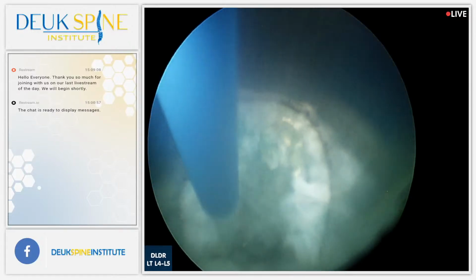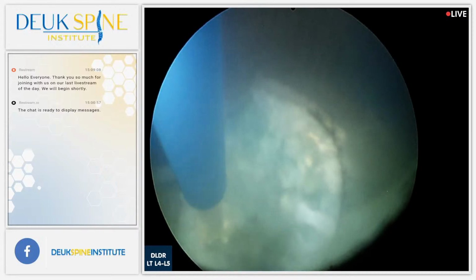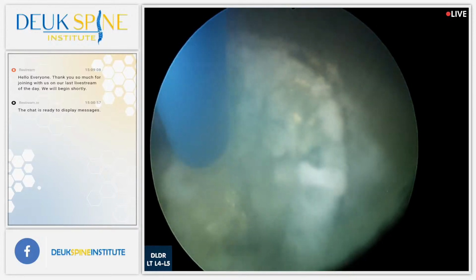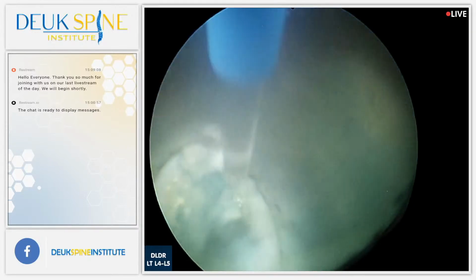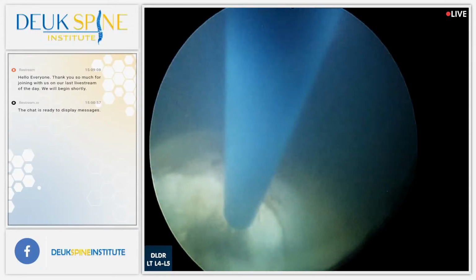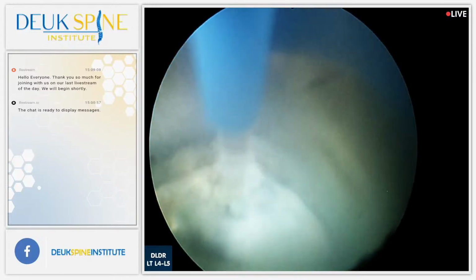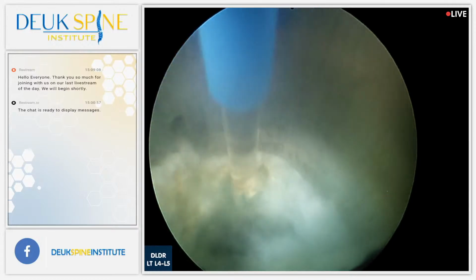Now, when I tested this disc just a few minutes ago, the patient was awake, and he said, ow, that is where I get my pain every day. It's concordant. And it was an 8 out of 10, meaning that it was pretty darn bad. He's a pretty tough guy, I will tell you that. So if he says 8 out of 10, you better believe it's painful. He is sleeping now as we fix his disc. After I do this, we're going to move on to fixing his facet joints with the Deuk plasma rhizotomy.